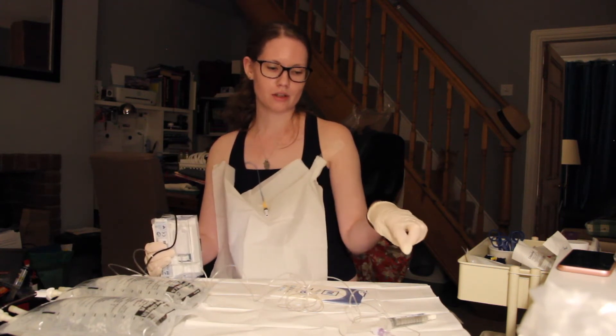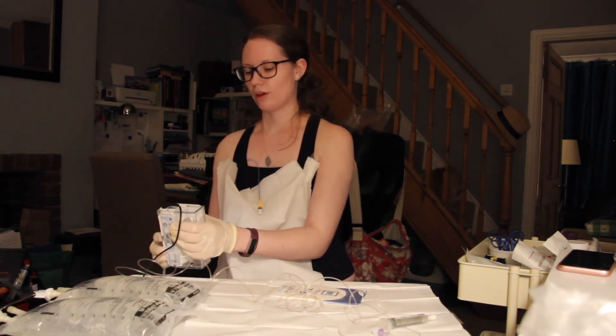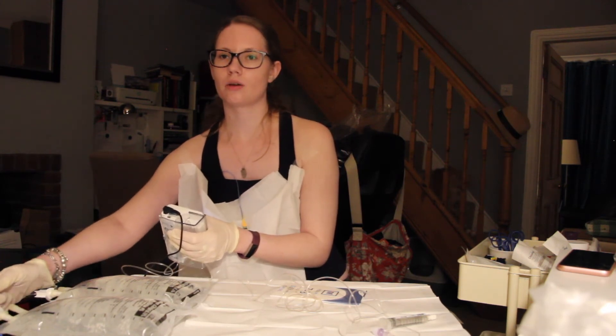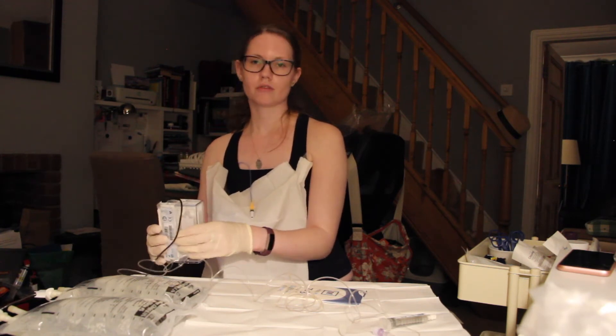Okay, so I can see it coming out now — so it's filled the line. Just wait for it to beep. There we go. So the next thing you do is close the line you've just opened and open the other line and do the same thing again — fill the giving set.